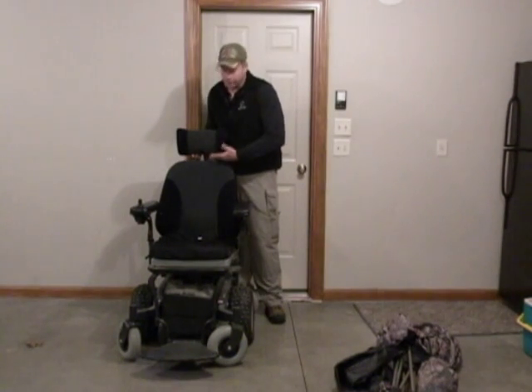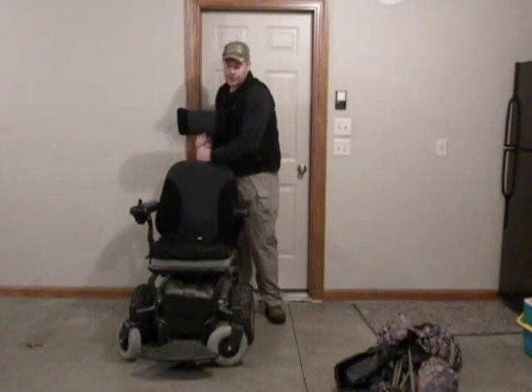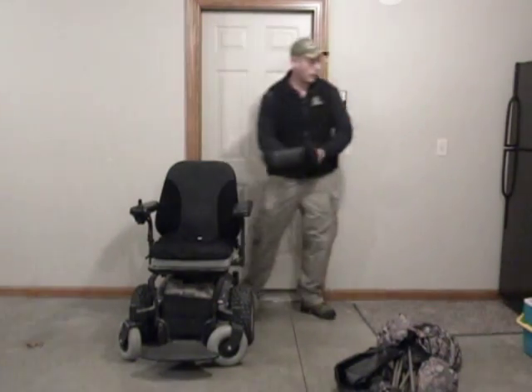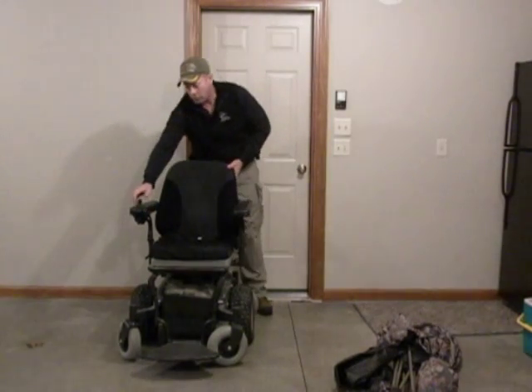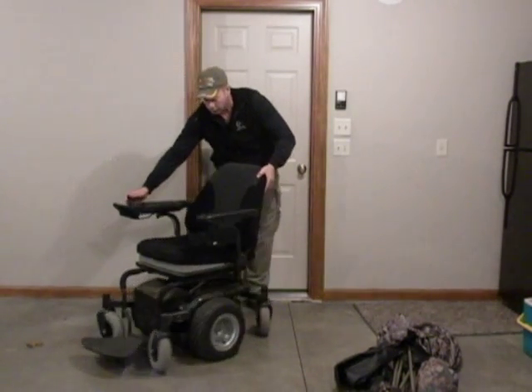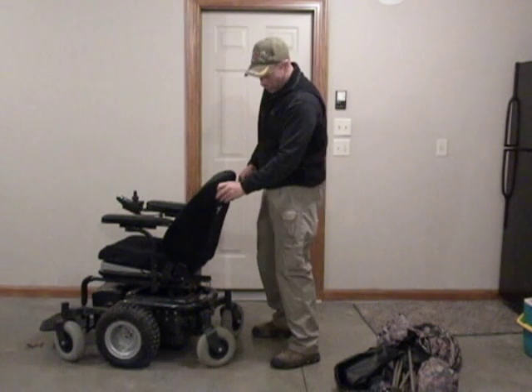First thing we have to do is get rid of the headrest — it may not work for everybody, but Noah doesn't need it, and that will just slide right off. Next, we're going to take the handrail off the backside so it doesn't get in the way of the back of the blind.